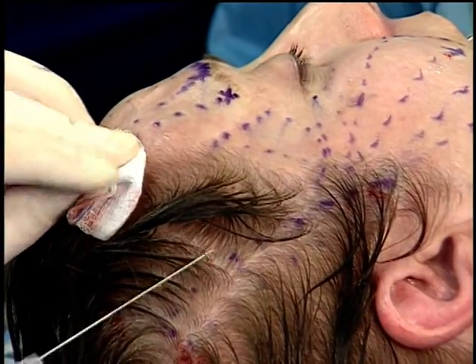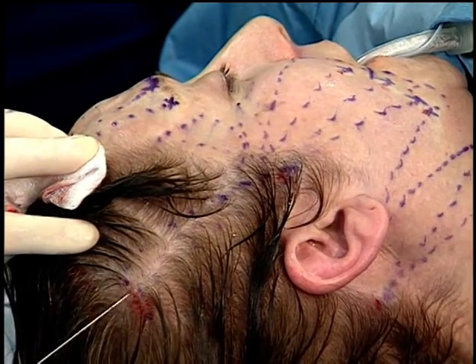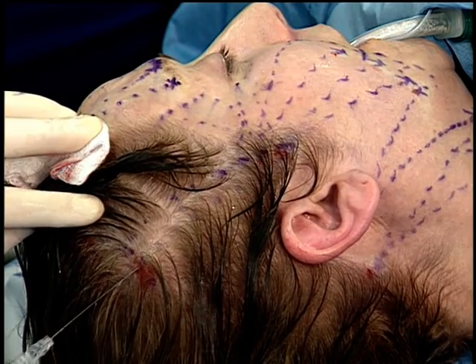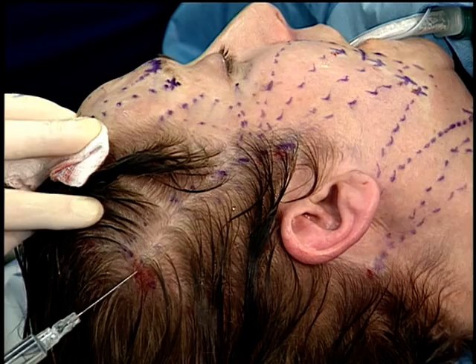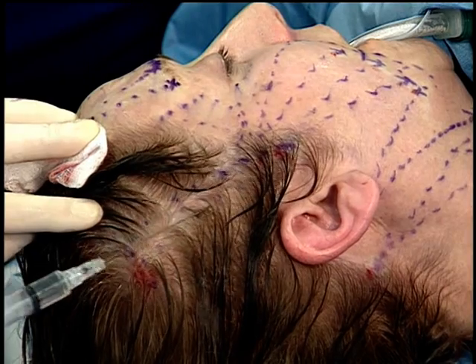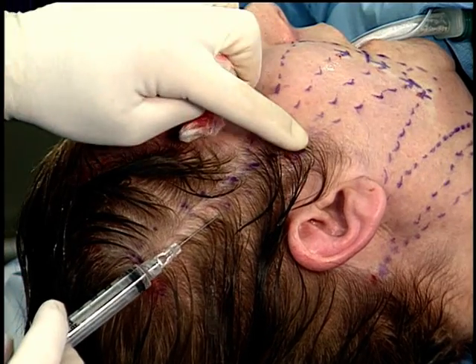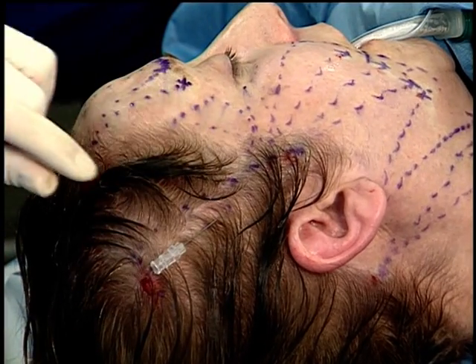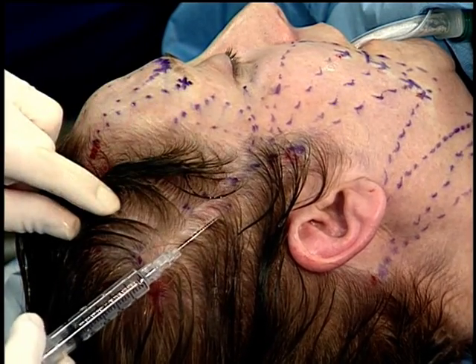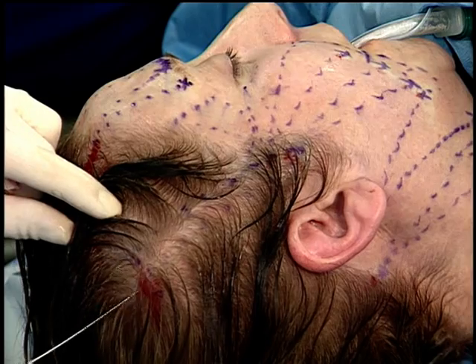The face starts with a U-shaped, or right side up, U-shaped loop lift using the articulus contour thread. And you get down into that temporal parietal fascia, that very, very loose areolar tissue, just above the superficial layer of the deep temporal fascia. You're sliding along that, doing hydrodissection right down to your exit and anchor point, an entrance point in the temporal tuft, right down to here. Now that took a lot more fluid, usually about 2 cc's to hydrodissect, and so now I'm going to pull back and infiltrate about 2.5 cc's along that tunnel, halfway point, come to the top, and infiltrate on the way back.